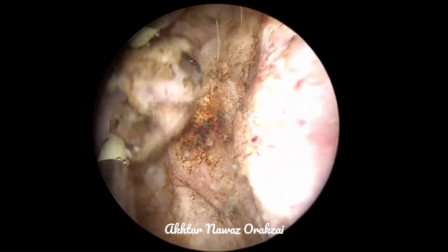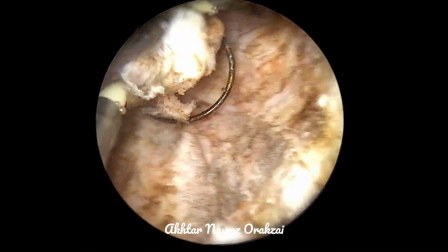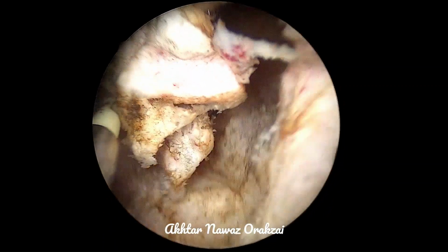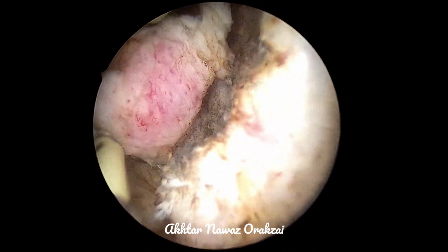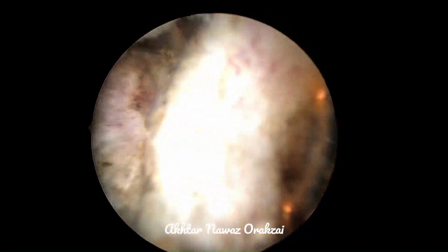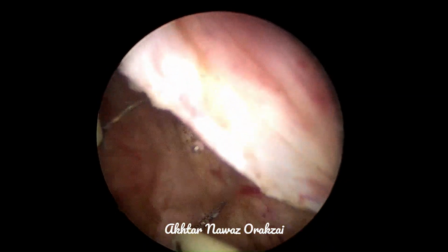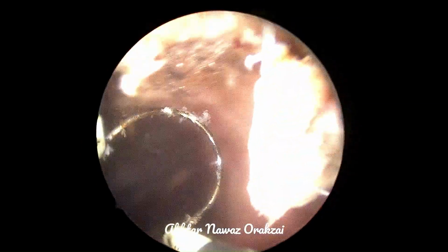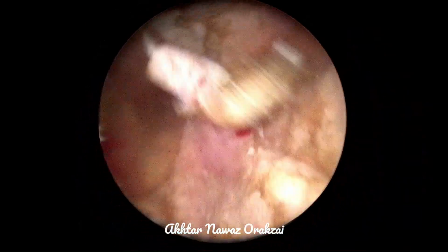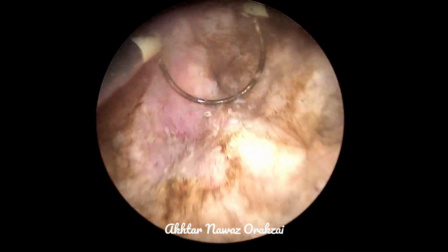So all these are indications that the bladder neck or bladder outlet is obstructed. So we are resecting the area near the verumontanum in order to reduce the obstruction, but at the same time not coming distal to the verumontanum, to avoid incontinence.